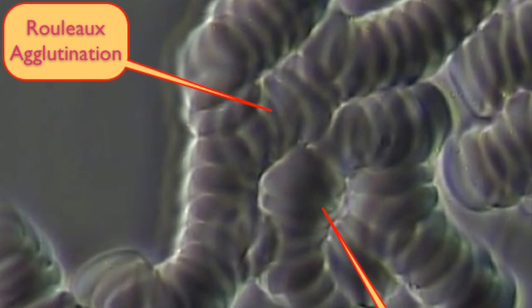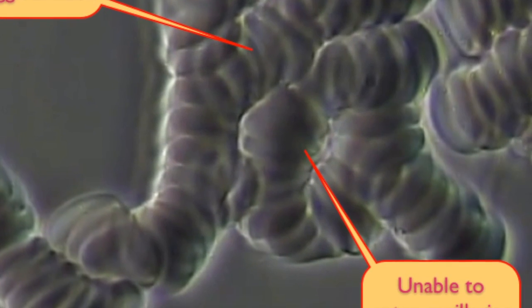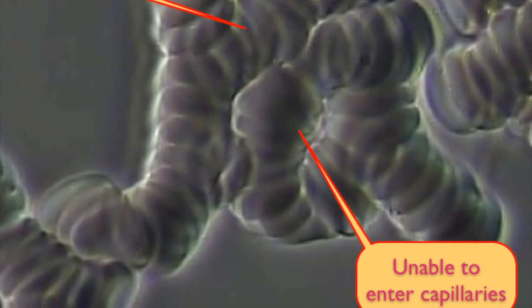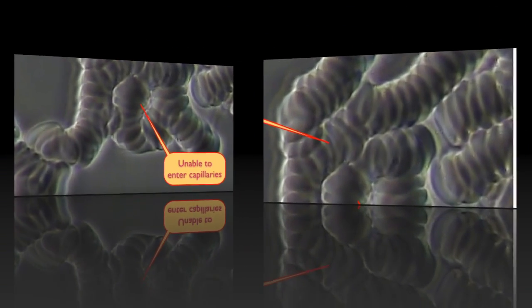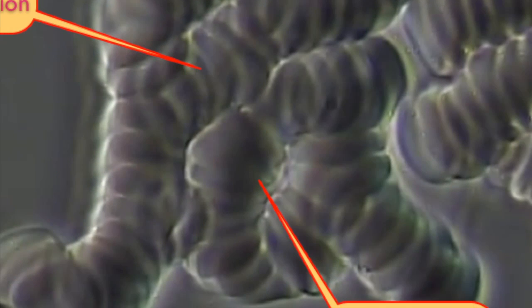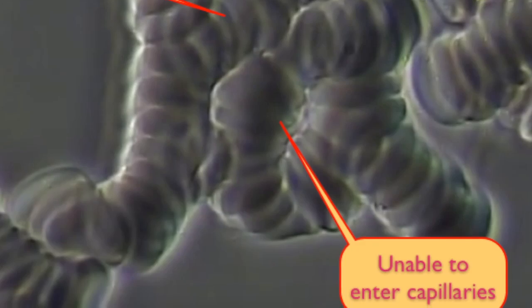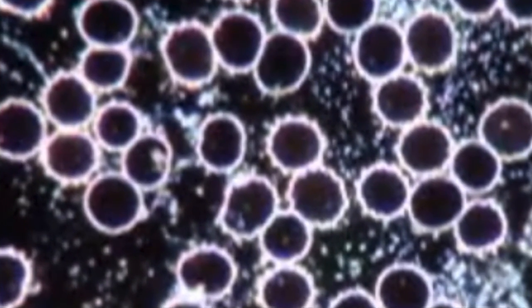In red blood cell agglutination, two erythrocytes adhering to one another are counted as one with automated counters. Larger clumps are not counted as red blood cells at all. This leads to a decrease in the red blood cell count and falsely elevated MCV. The degree of red cell agglutination induced by high molecular mass polymers is dependent on hematocrit.